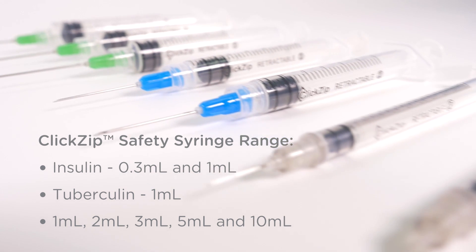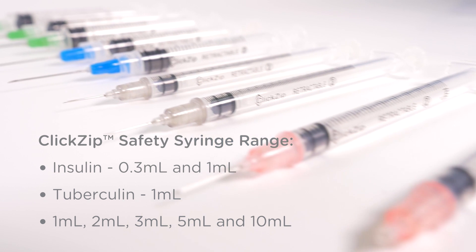tuberculin 1ml, and 1ml, 2ml, 3ml, 5ml and 10ml.